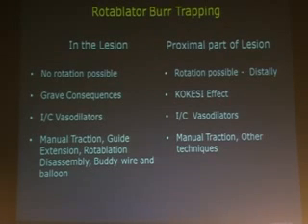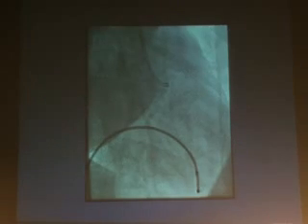Now, this is called the Kokeshi effect, named after a Japanese doll. Here, what happens is that you can go distally, but you cannot come back proximally. So, for the sake of clarity, I'll run the angiogram again, and now I'll try to emphasize what went wrong.